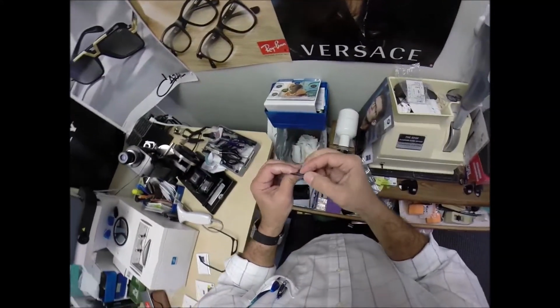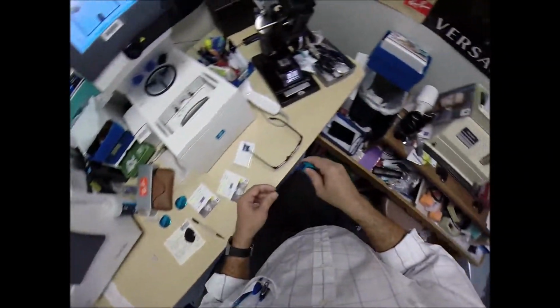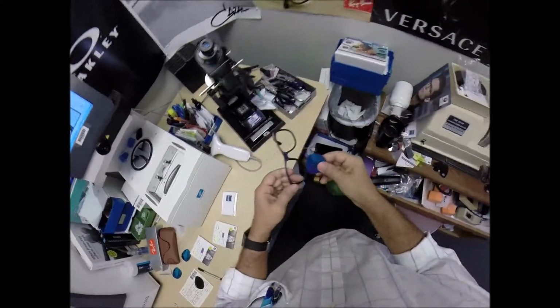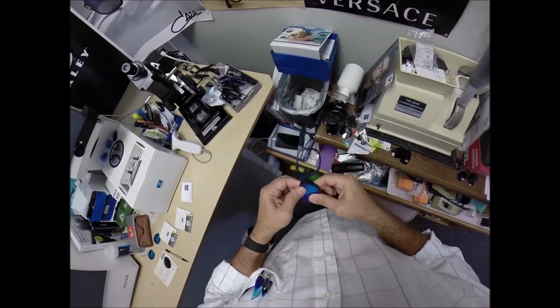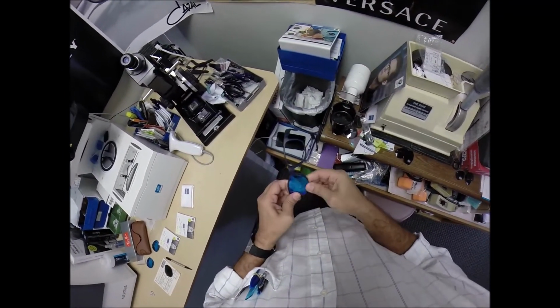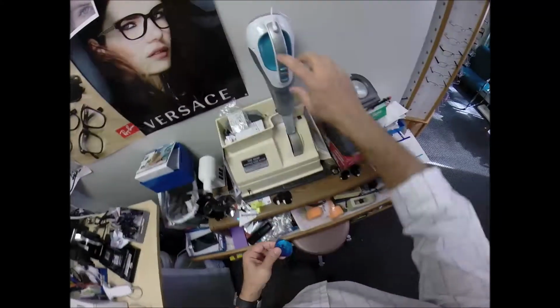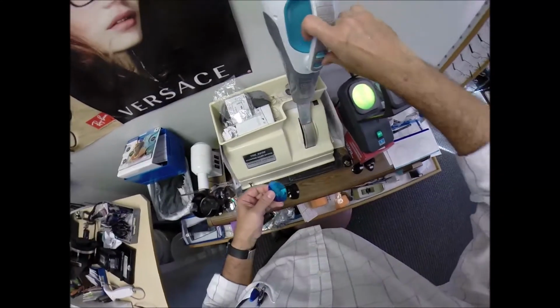Make sure all the sawdust is off. It's still soft on my hands. See if this fits or if I have to take it down some more. Yep, take it down a little bit more. Okay, turn your volume down.